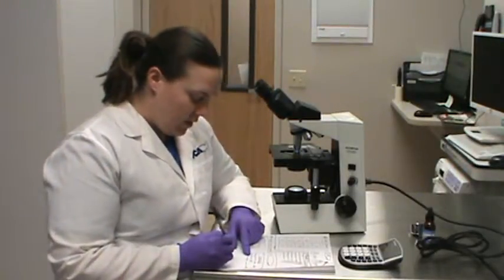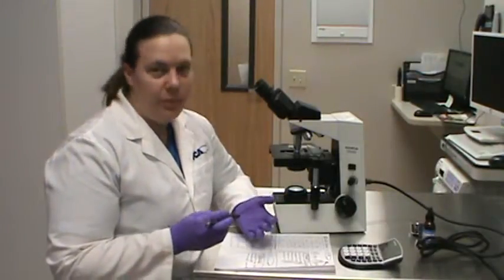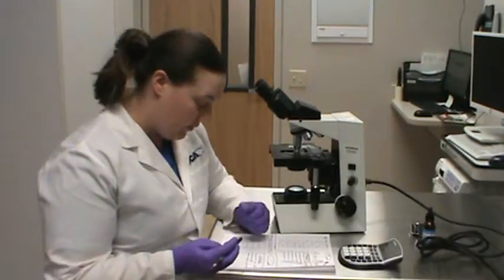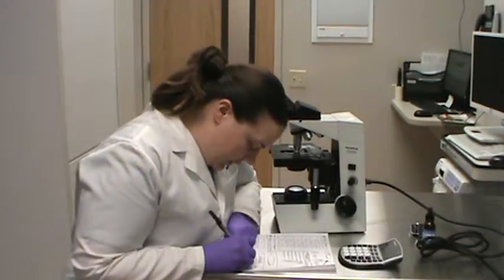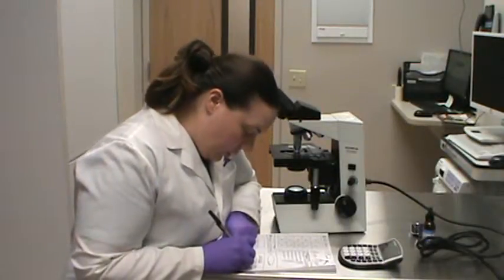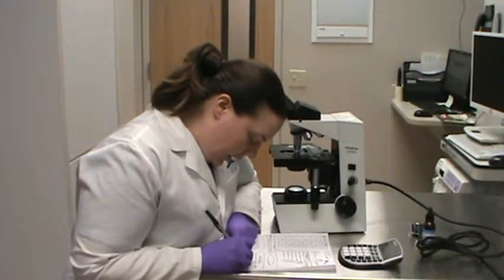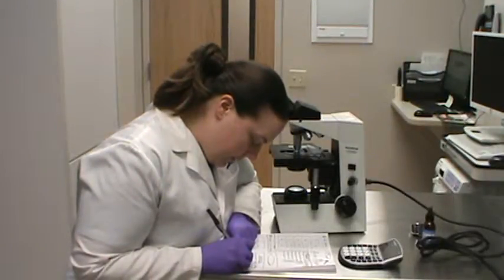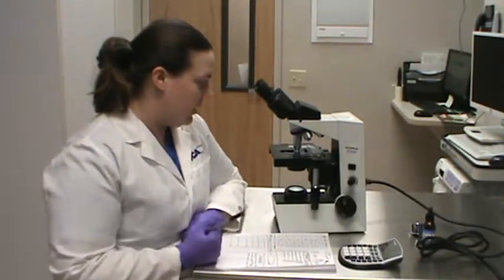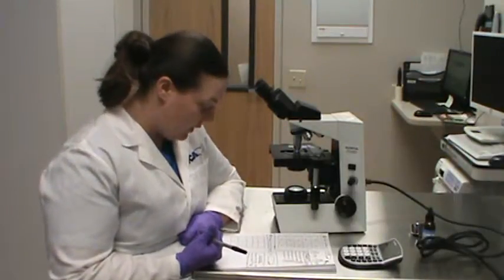I did see some crenated red blood cells, about 1 to 2 per high power field. But other than that, everything I've seen on my slide looked relatively good. So I'm pretty happy for this friend.